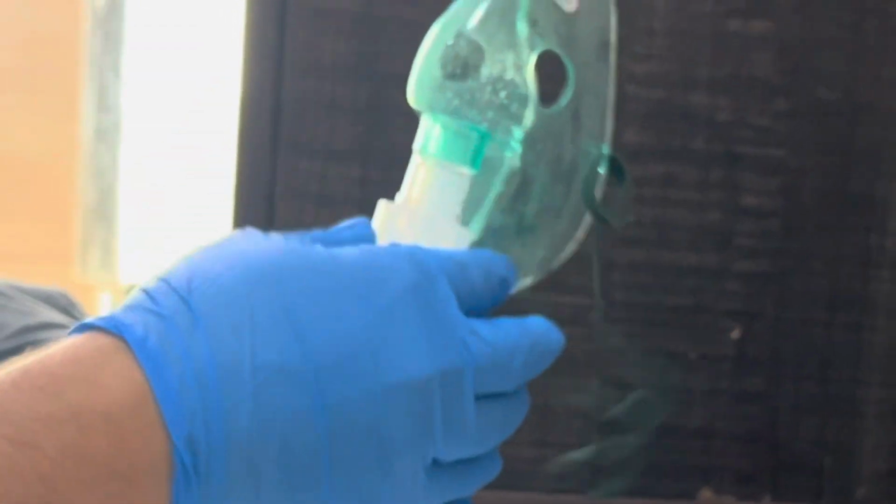We have a lot of medicines, such as Atrovent and Ventolin mixed with normal saline. We put the medicine in it. Then we can close the nebulizer mask as you can see in the video. Once you close the nebulizer mask, then it is ready.